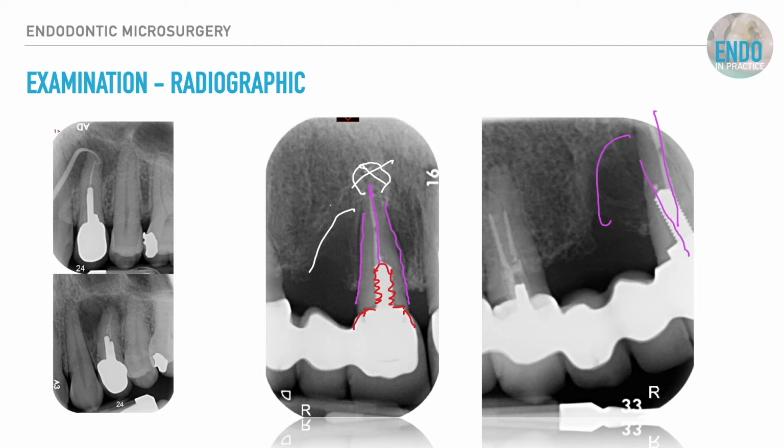Now, you very rarely perforate with the actual post cementation. What you do is you perforate with the post preparation. And if I delete some of these, you'll maybe be able to see, if you look really closely, just at the radiograph, I'll highlight it, just here beyond the actual post itself, there's a radiolucency, and that's usually suggestive of the post has gone offline and actually it's popped out the root itself. So a radiograph from two different angles provides a vast amount of information such that you can come to a much more accurate diagnosis.